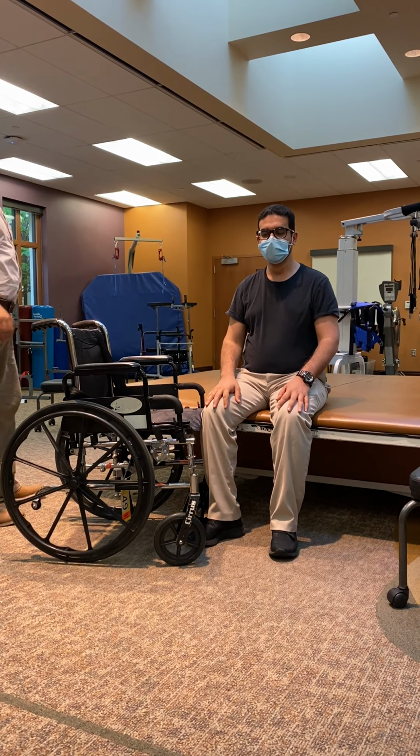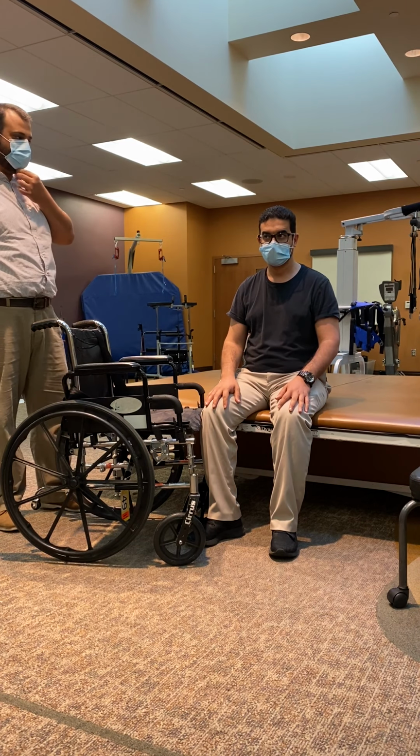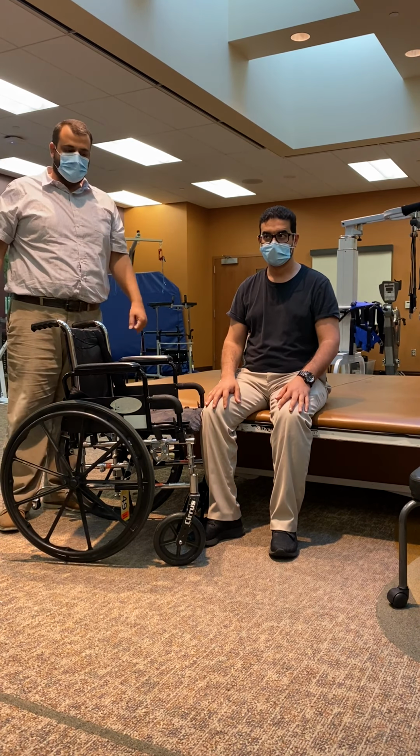In this video, I'm going to demonstrate the squat pivot transfer or flex pivot transfer. This transfer, as you might notice, has more than one name. It has squat pivot, flex pivot, and sit pivot transfer. So we have our patient here who has left hemiplegia. I'm going to try to transfer him to the wheelchair.